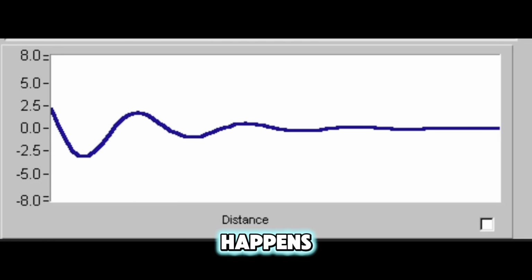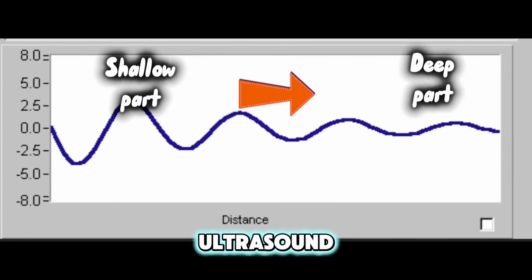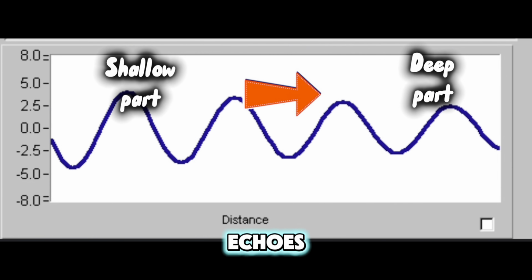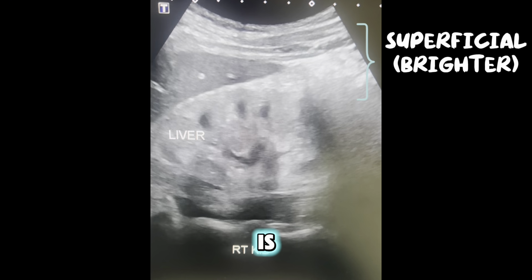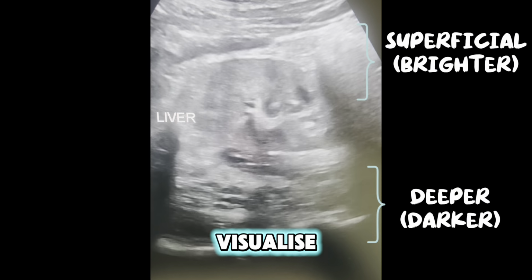What really happens to the wave? The main thing that changes is the amplitude. As ultrasound travels deeper, the wave loses energy and the returning echoes are weaker. This is why deeper structures may look darker and be harder to visualize.